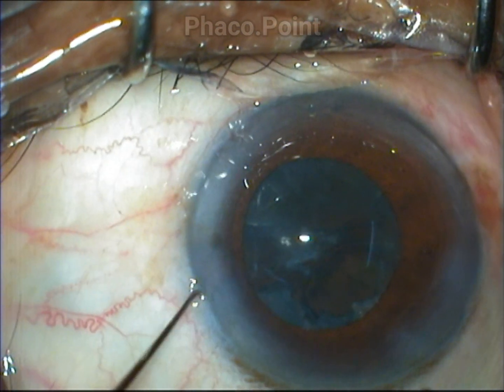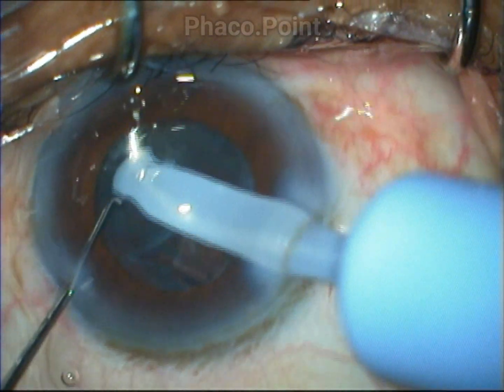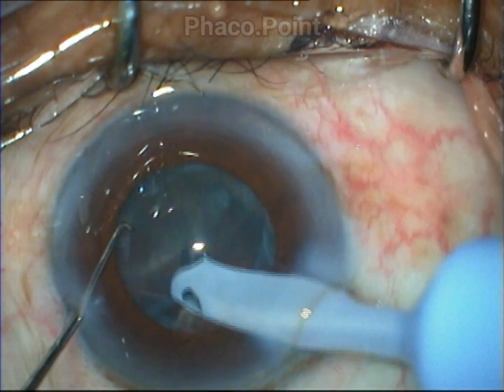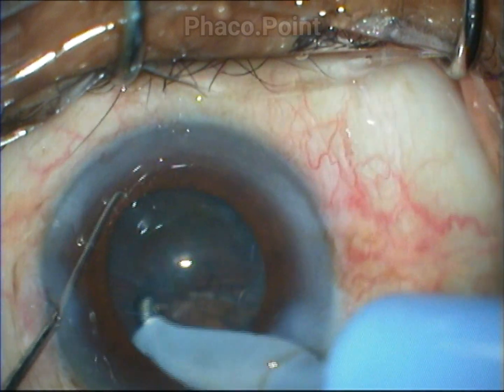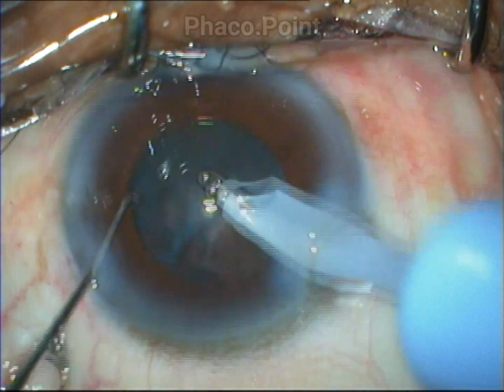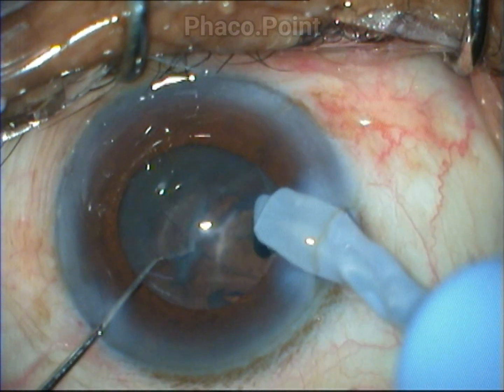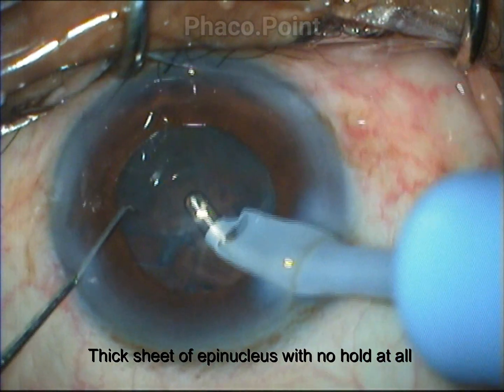This is the technique which is most recommended if you are confronted with an epinucleus plate or epinucleus shell. The best way to float the epinucleus shell out of the posterior capsule and into the safe zone is by visco dissection.